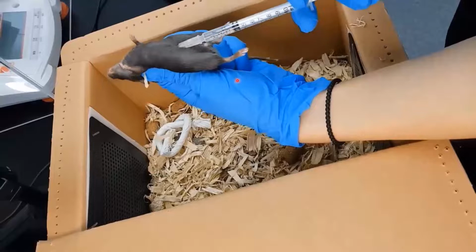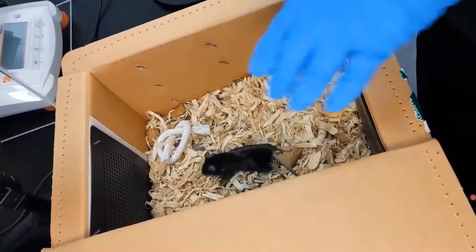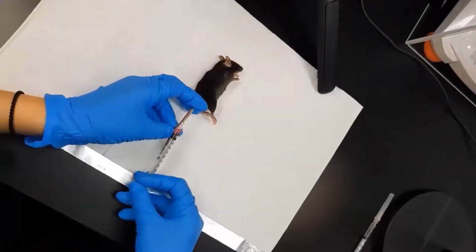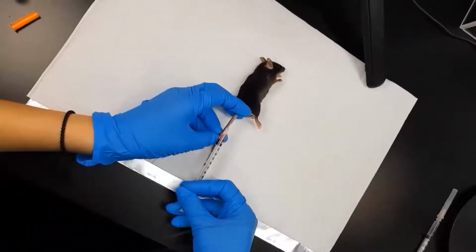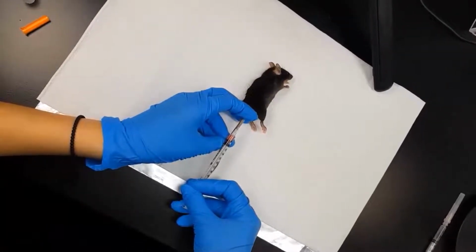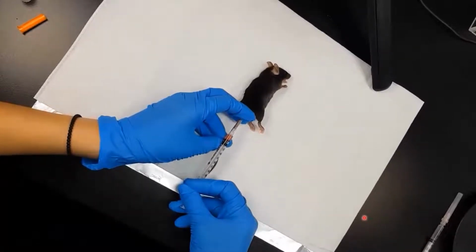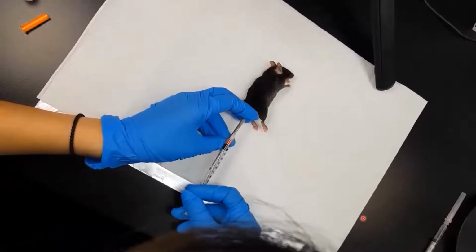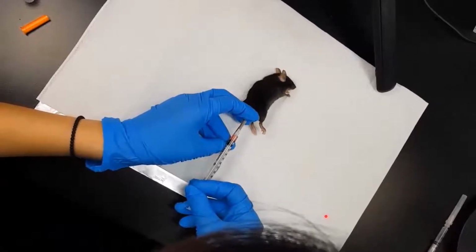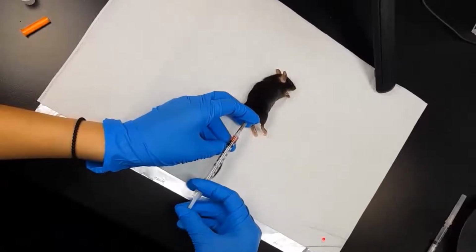Firstly, we anesthetize the mouse by IP injection of the ketamine and xylazine cocktail mixture. Before imaging, the blood vessels were fluorescently labeled by intravenous injection of anti-CD31, the PECAM monoclonal antibody conjugated with a fluorophore, or various fluorescent dyes such as FITC, TRITC, rhodamine B, injected via tail vein for in vivo labeling. So here, TRITC dye was intravenously injected to the mouse model through the tail vein.